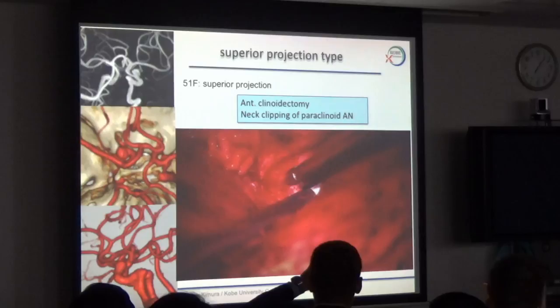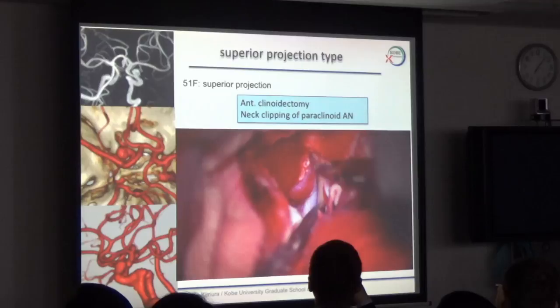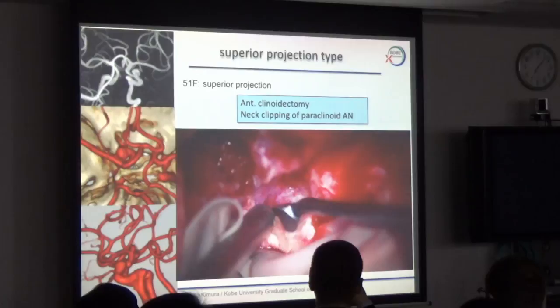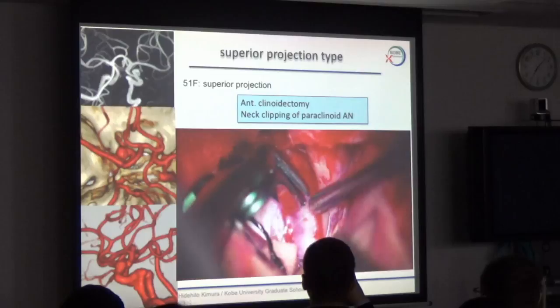However, around the tip of the anterior clinoid process, you should use a meticulous drilling procedure. The anterior clinoid process was partially removed, and once inside the dura, we confirm the intradural structure. So you can see the aneurysm dome here, and the remaining anterior clinoid process here. This is the remaining anterior clinoid process, and after that, the meticulous drilling procedure was launched once again. The remaining tip was removed carefully, and the aneurysm dome was sharply dissected from the remaining dura, and the dome was really exposed. It's also red, about to rupture. Yeah, so a risky aneurysm, and the clip was applied. No problem.